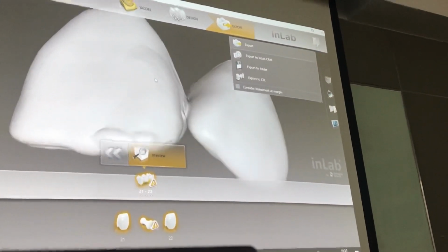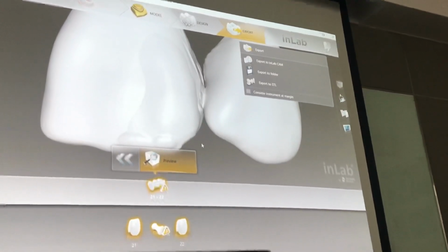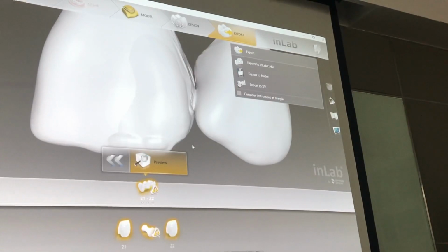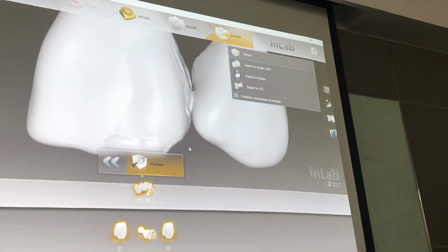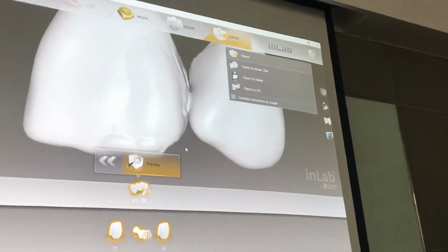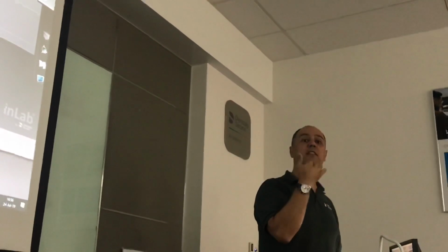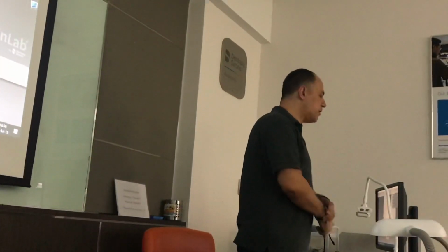If by any chance the tooth is a bit long, then they'll incise the ledge or the cusp or whatever is coming out of that mock-up that you've done. They'll paint it with a black marker, put a black reflector, take a photograph, and then when the patient smiles, they don't really see that. It just looks like one because of the black background. So when they assess that, they say, okay, that's what I want. And then you know that you're on the right track. So they prep according to that. Make sense? So this is one way of doing it: you mill it out, send it to the dentist, and they can do that.